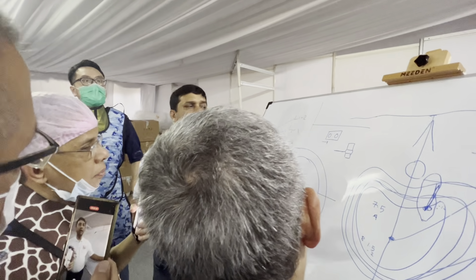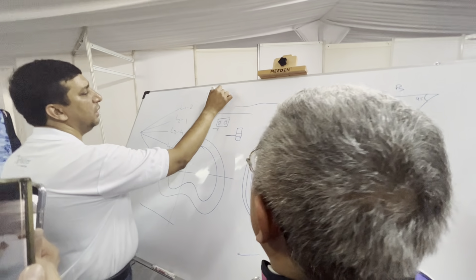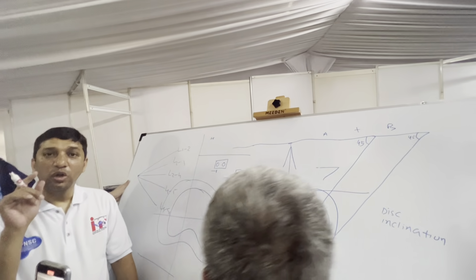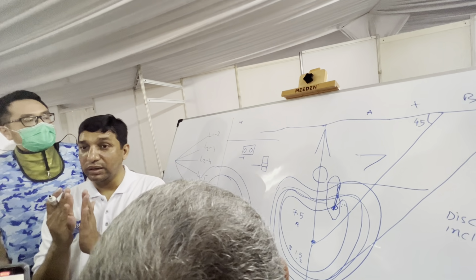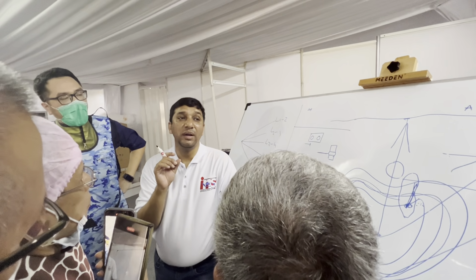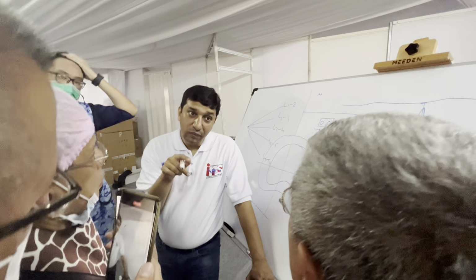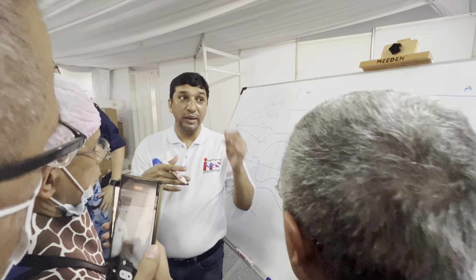So you put the needle. Before this, I said needle entry starts in the AP view. We go to the facet. You don't cross more than the lateral margin of the facet in the AP view, and it should be less than 10 to 11 centimeters. If you keep going to 11 centimeters and still don't touch the bone, you stop. If it is not correct, you take the lateral view and make the adjustment.